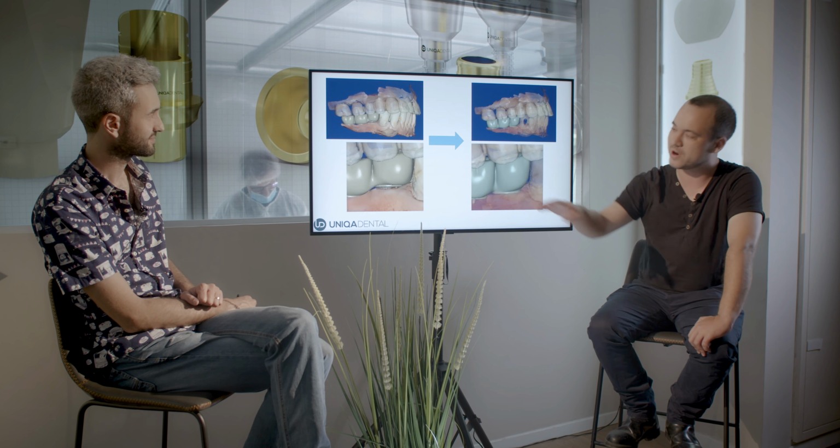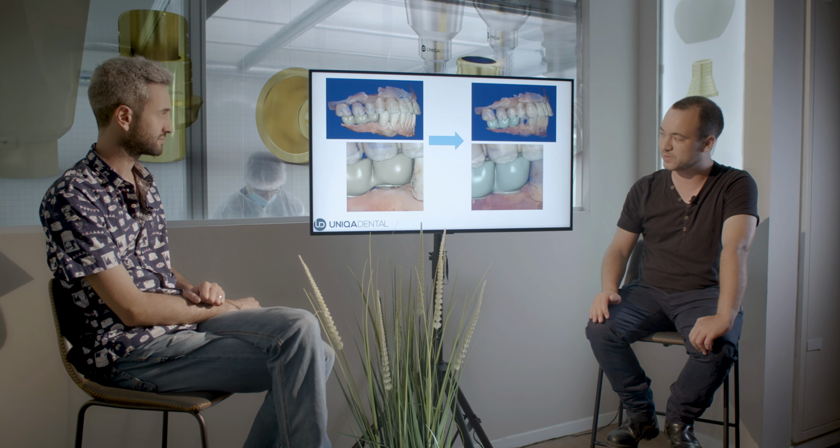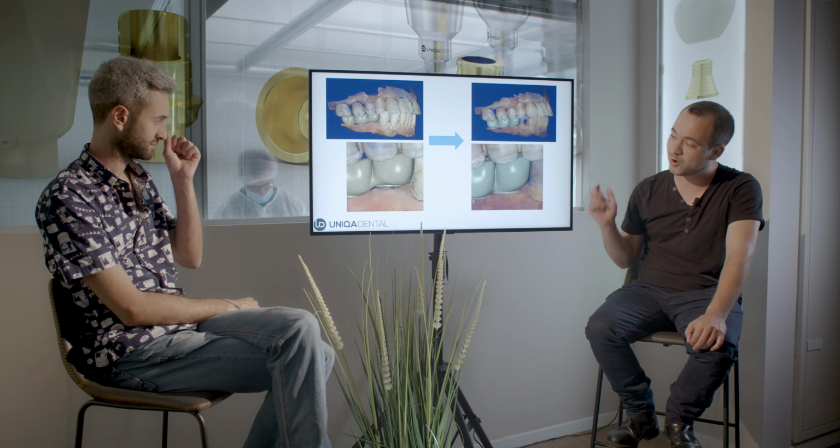And how does it connect to our case? In the original design, you can see the base of the crown was about half a millimeter above the gingiva and the base of the multi-unit. But when we changed it, you can see the base of the crown is about half a millimeter below the gingiva. So what you get is a crown that's a little bit longer, that won't fit onto the multi-units that the patient has in the mouth. The technician needs to tell the doctor to change that multi-unit from, I think it's 2 millimeters to 1, and then the doctor can just fit in the bridge and everything's supposed to work.